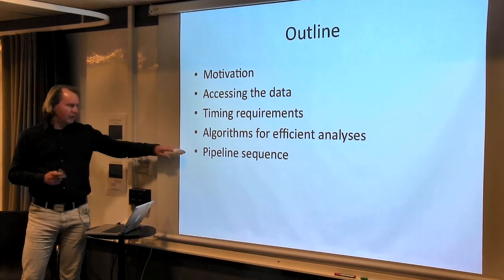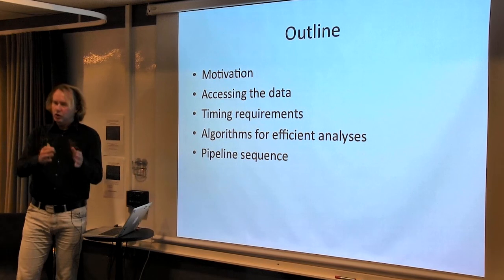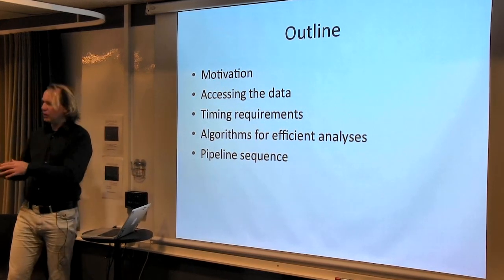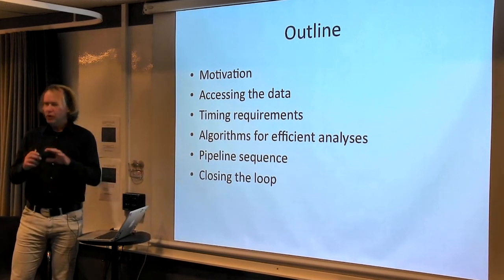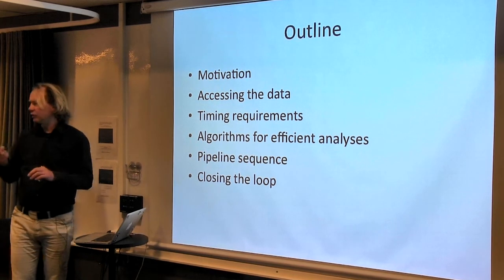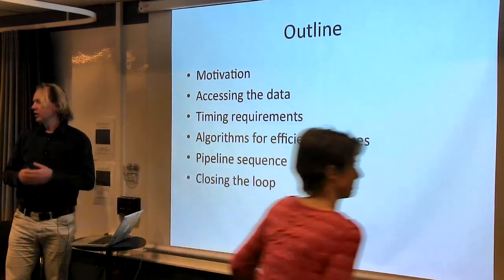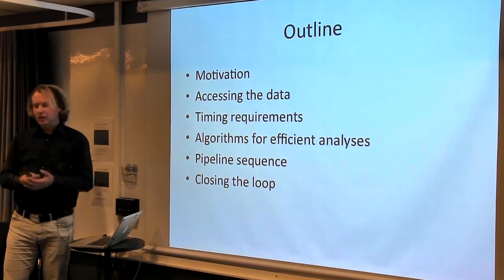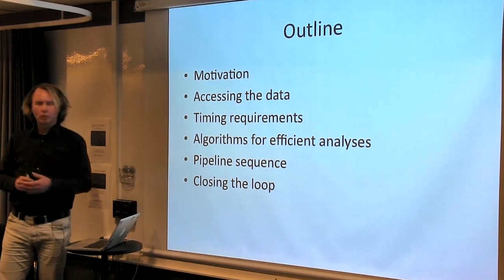Finally, I will tell a little bit about the pipeline sequence, how to make an array of analysis working, and eventually how to close the loop. Because the whole point of doing real-time analysis is that you want to do something with the outcome of analysis in real time. Just analyzing the data in real time and not doing something with it is not a very efficient investment of your time, because that's also something that you can do offline.